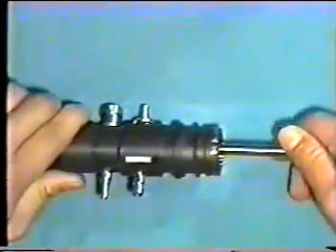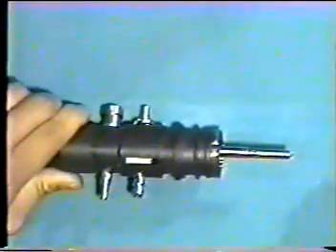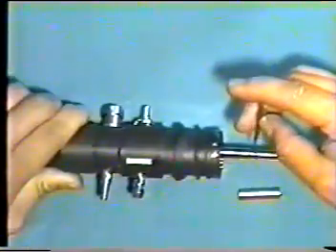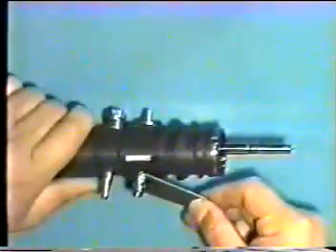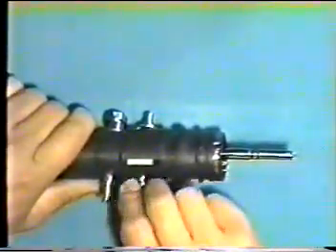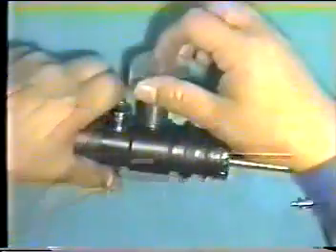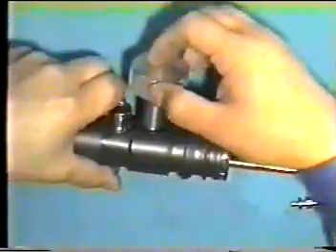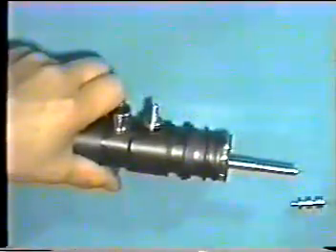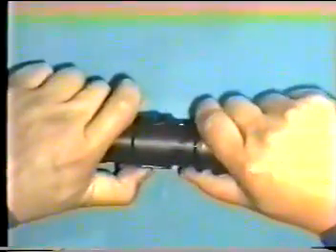First, remove the sleeve. Loosen the set screw. Remove the S connector with a spanner. The ventilation connector can be disassembled using the dedicated tool after loosening the two set screws. Extract the connector body carefully without applying excessive tension on the wires.